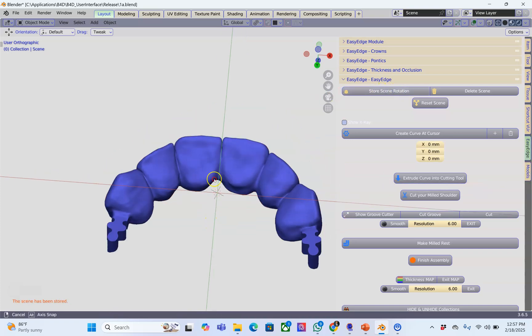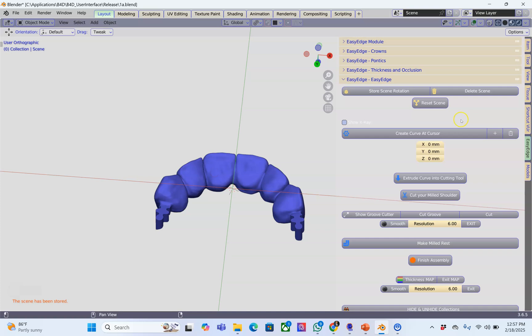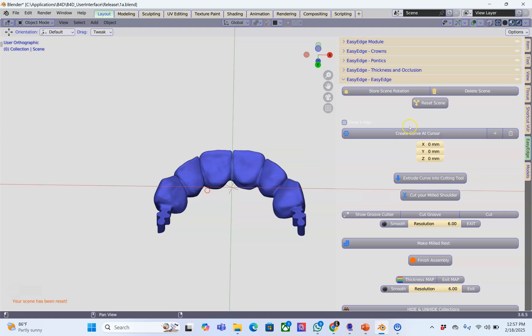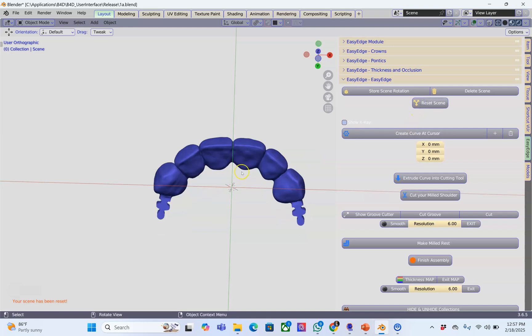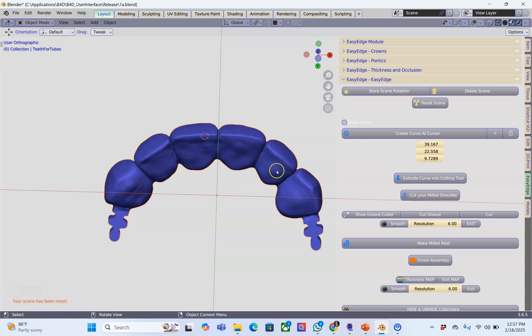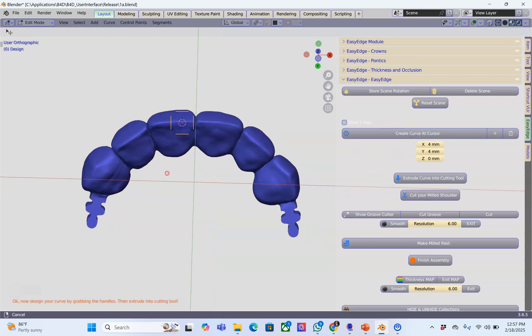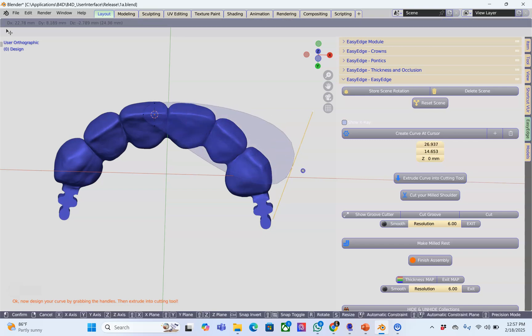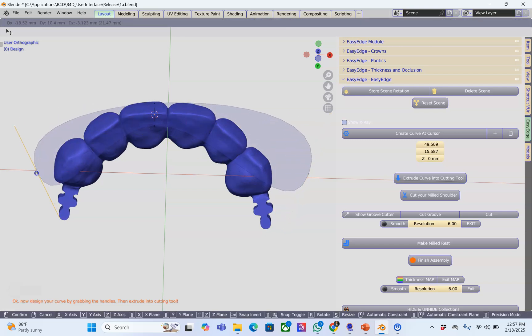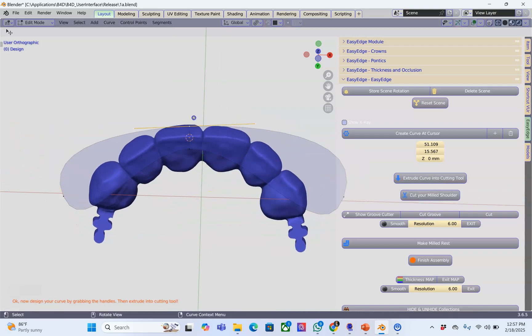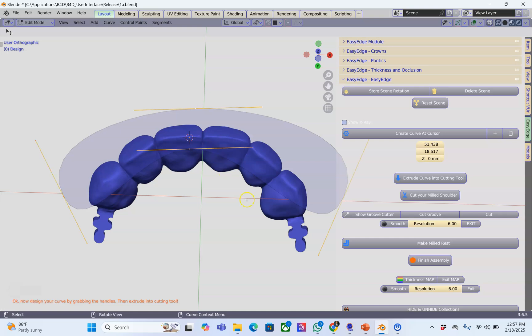When we store the scene we can easily reset the scene. Over here we would delete the scene if you want to make a new scene. Now I'm going to select the bridge, place my cursor and then create a curve. This curve needs to be extended all the way this way and over here as well. I want to put more points down so I'm going to press A to select all of them and click on the plus sign.